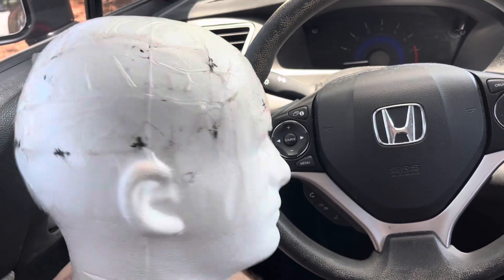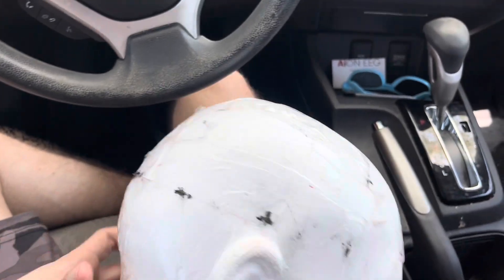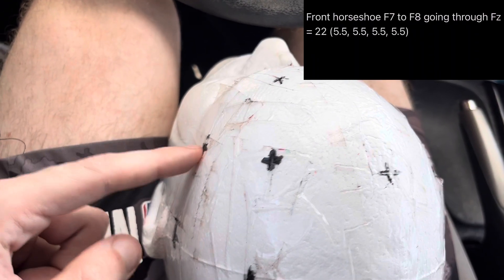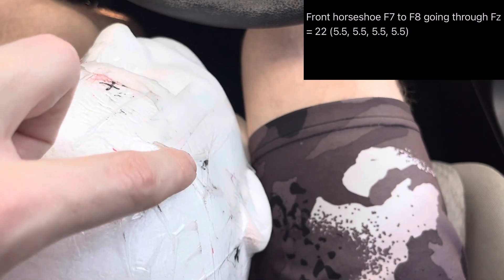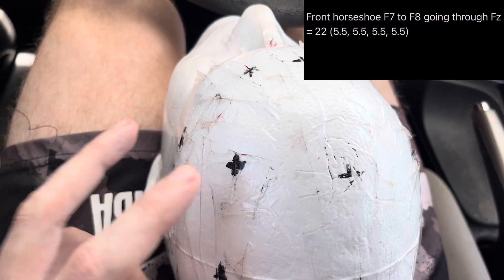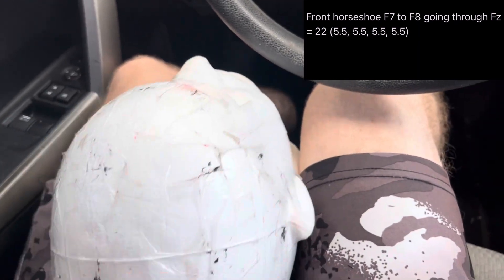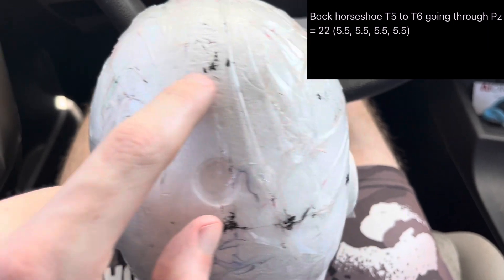Once you've got front to back, side to side, and the headband, the next step is the front horseshoe. You start from F7, go through Fz, and all the way down to F8 — it looks like a horseshoe at the front. Let's say that measurement is 22 centimeters, so the spacing is all 5.5 cm: F7 to F3, F3 to Fz, Fz to F4, and F4 to F8.